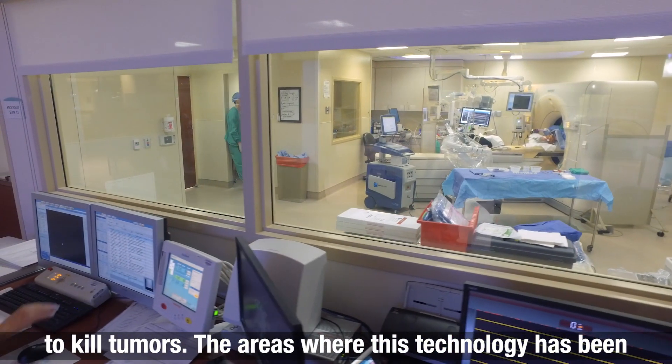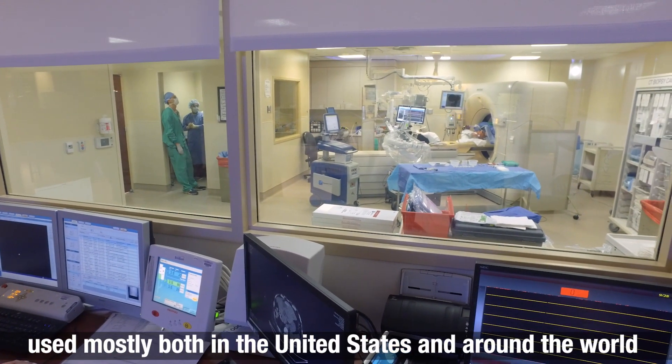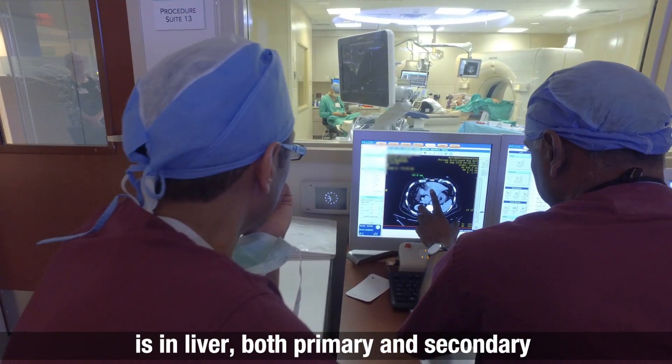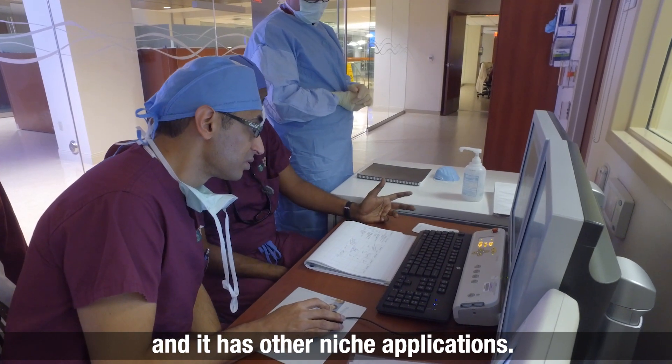The areas where this technology has been used mostly, both in the United States and around the world, is in the liver — both primary and secondary — and it has other niche applications.